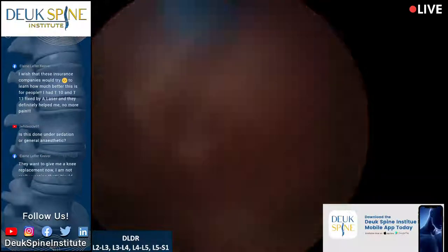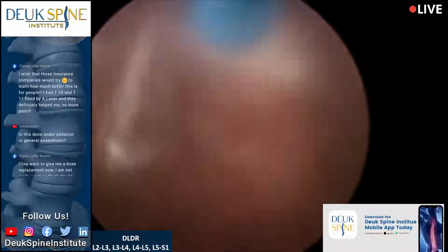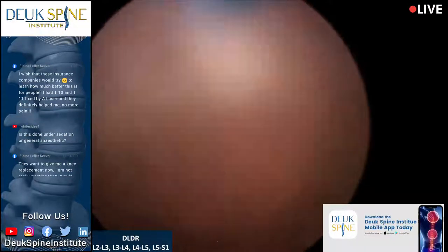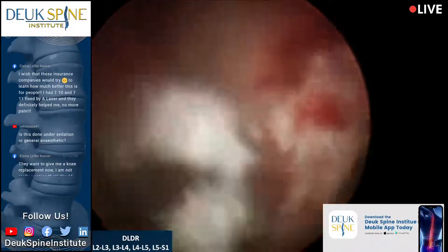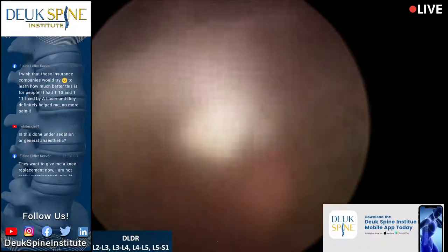Okay, I need about 2 minutes. Doctor, I'm already on the annular tear with the laser. You guys can see at 12 o'clock the blue laser fiber. And I got to clean up this tear and we'll be done.